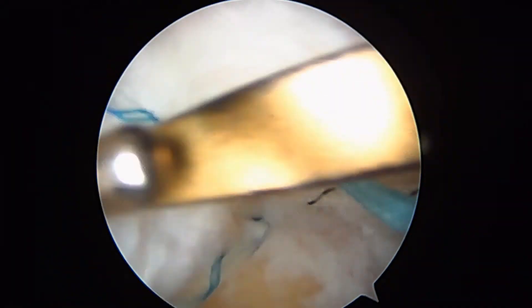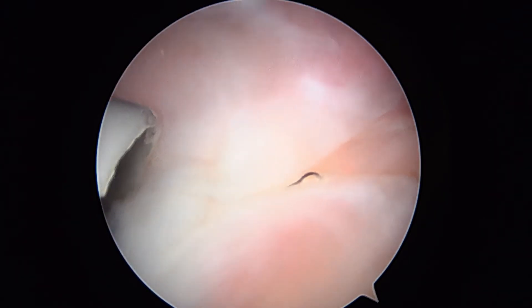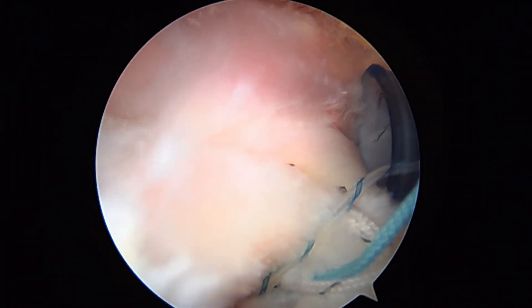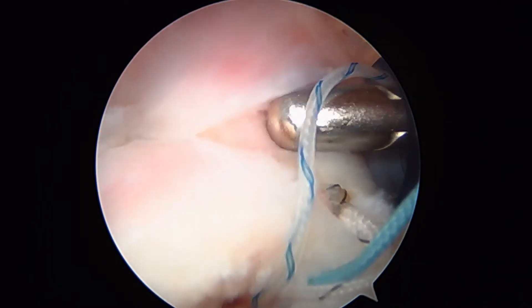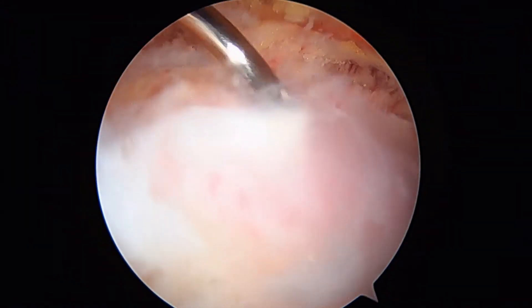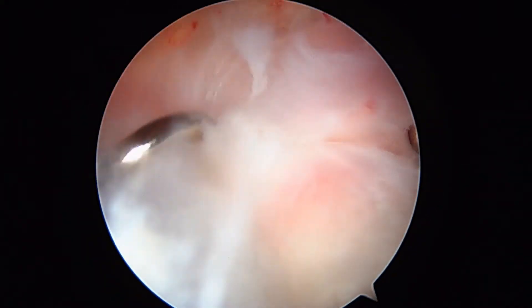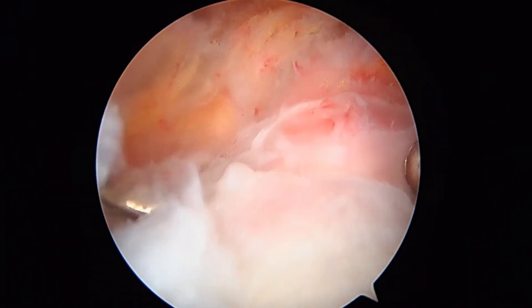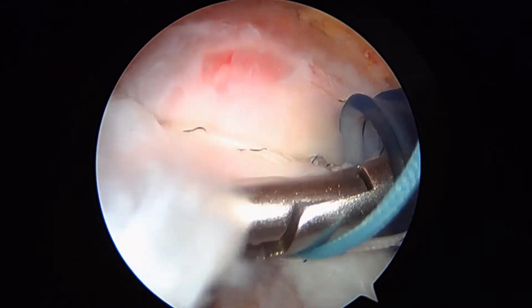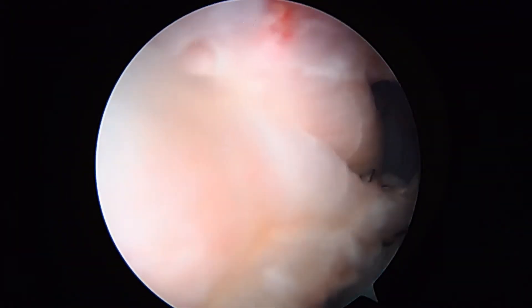We're going to get the final suture coming from an anchor, which is this blue and white suture. We'll pull this out the back this time. Now we're going to be passing a stitch from the front. We'll take a grasper in the back of the shoulder, coming through the blue cannula on the right. Now we'll take a suture hook — this is going to be turned to the right. There's our tear. The type of stitch we're trying to do is just like that. There it is coming underneath — that's a good bite right there. I'm happy with those suture passes through the tendon.